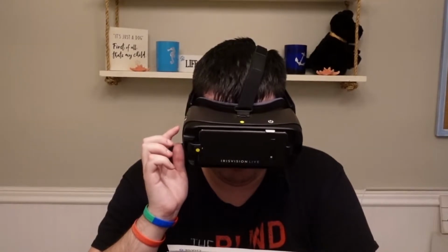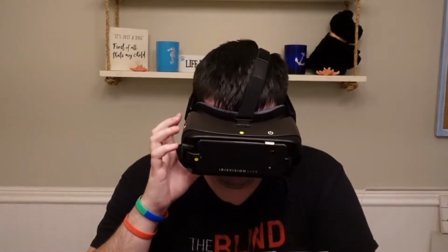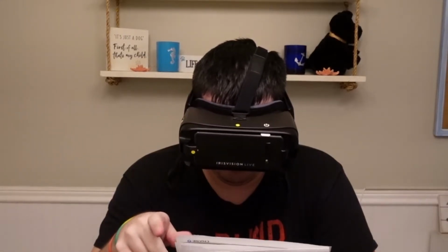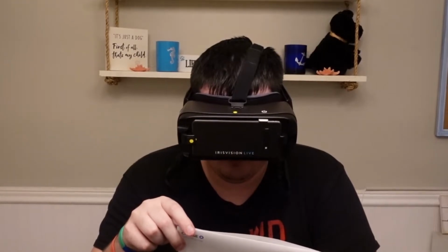I think you might need this. Yeah, it puts a big old line in the middle of the text, making it easier for you to see what line you're reading.